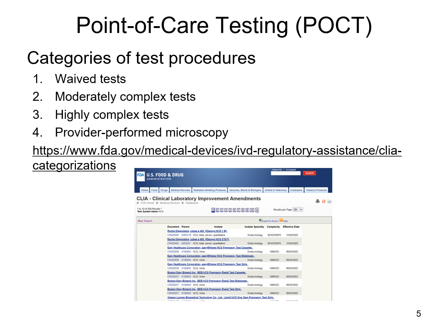And so the different categories include waived testing, which means that the regulations for it are a little less stringent, and this is usually considered testing that could be done at home. So some examples of waived tests would be like a home pregnancy test or the COVID testing, things like that. Some of your diabetic strip testing, glucose monitors.